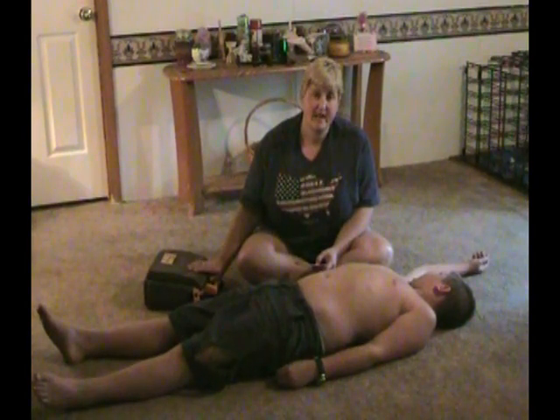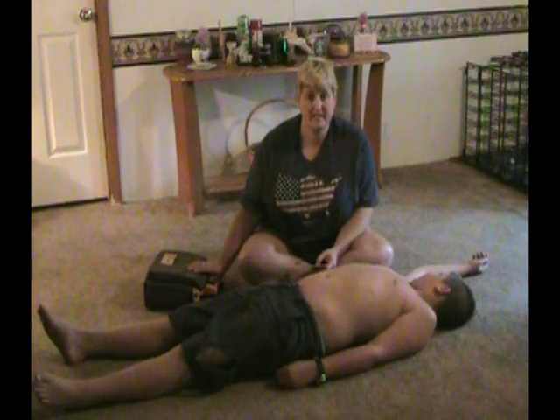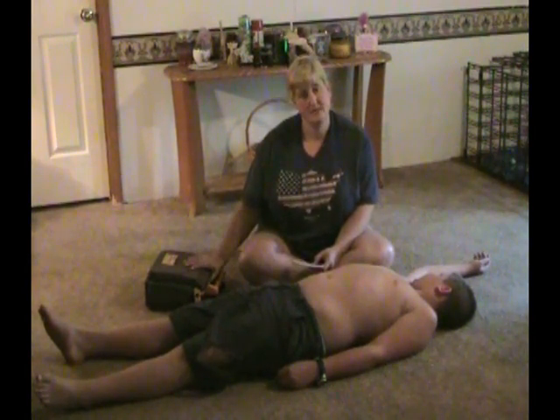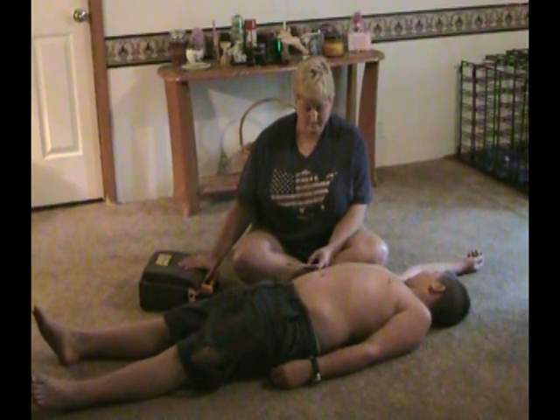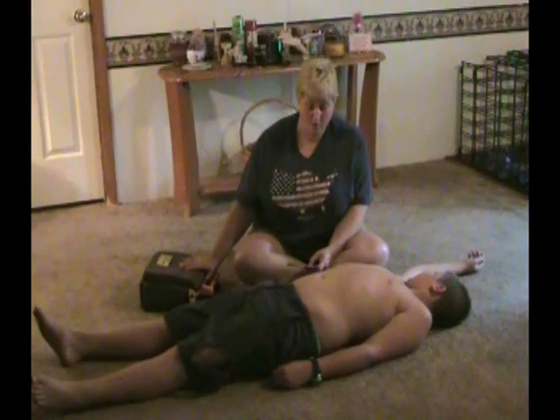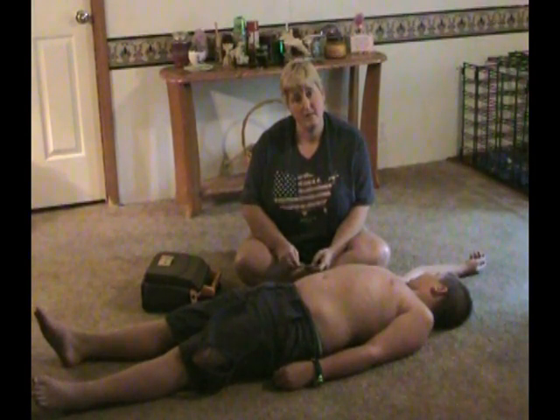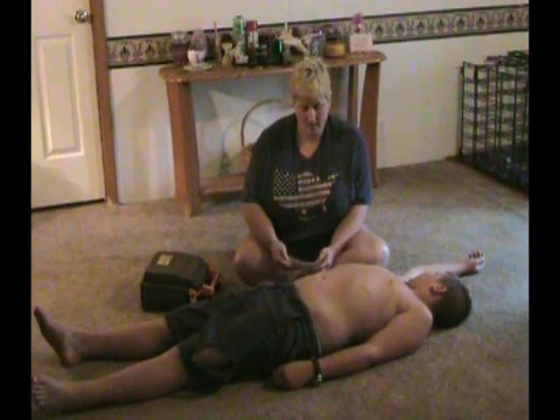The victim you may encounter may be your loved one, and your quick response could make a big difference in their survival. Today we'll cover the steps of how to use an AED and apply it, to become familiar with how it works, and as we will see, it's got audio commands and pictures to guide you through the steps.